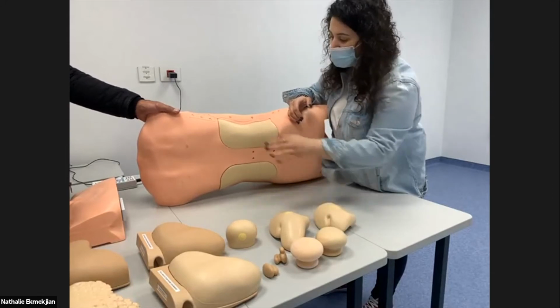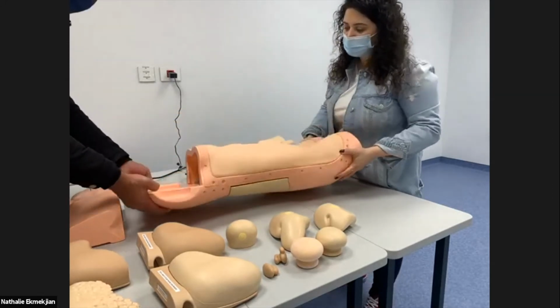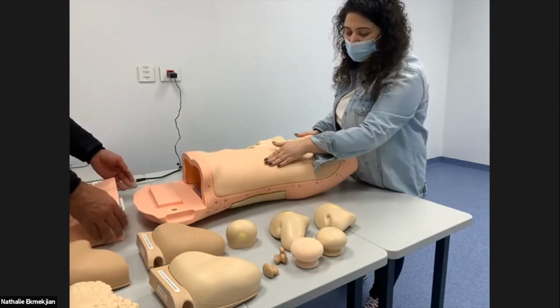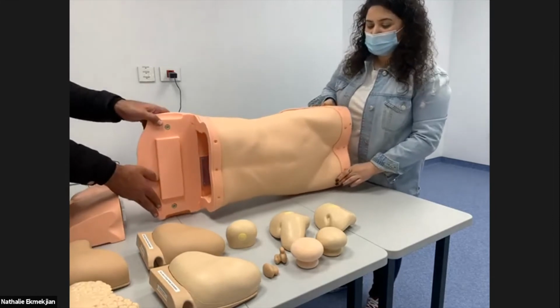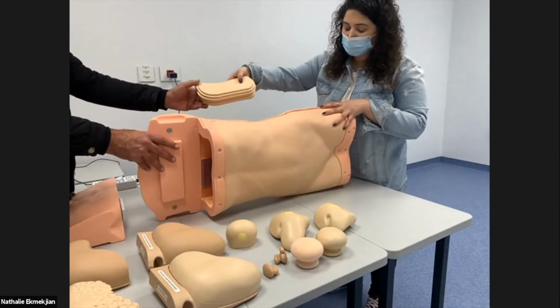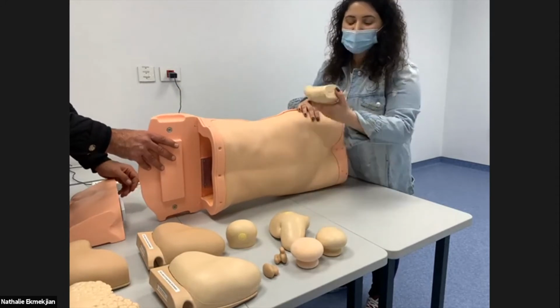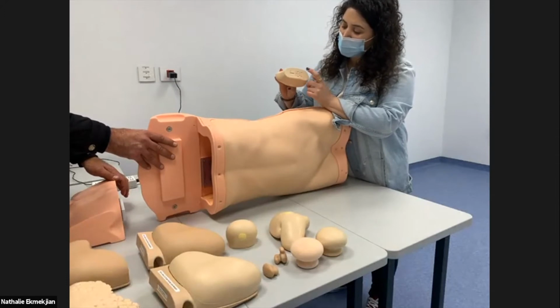Okay, now we put the interchangeable kidney, and we are ready to palpate. On the second place, we can put one of these pins. Again, the head up.